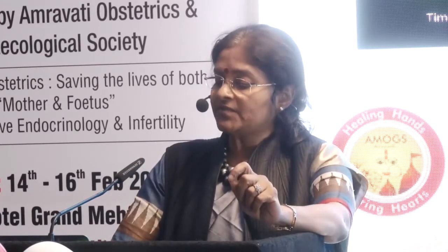Doppler measurements can be added in the uterine, umbilical, and the fetal MCA. It can also be used to reassess the fetal anatomy, in the same systematic way as in the second trimester, but it is limited depending on the fetal position. There could be some problems. We cannot evaluate things like the fetal face and extremities in the third trimester as well as we can in the second trimester. All cases of suspected fetal abnormality have to be examined by a specialist, and then we may even have to refer them to a fetal cardiologist if we suspect any anomalies.